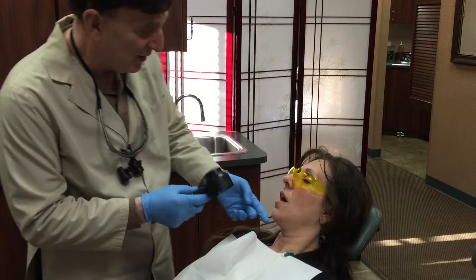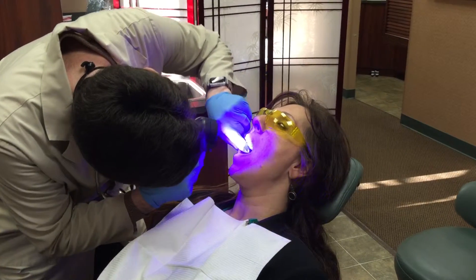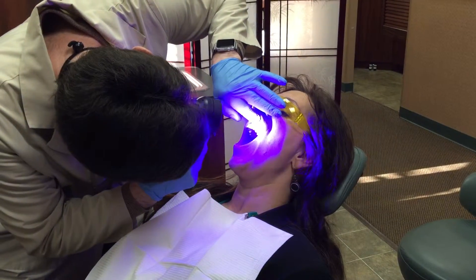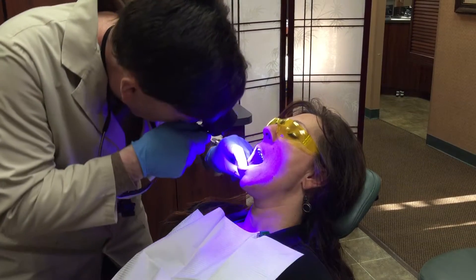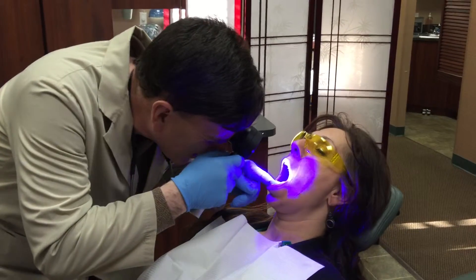And we're looking for anything that's abnormal. So if you lift your chin up a little bit and open real wide for me, we're going to take a peek. Now all the tissues are turning a green color and they all look nice and healthy. We're looking under your lip, and we're going to look under your lip on that side. Pull back your cheek, look on your cheek. We're going to look under your lip on the bottom, and we're looking on the other side for anything that looks a little abnormal.